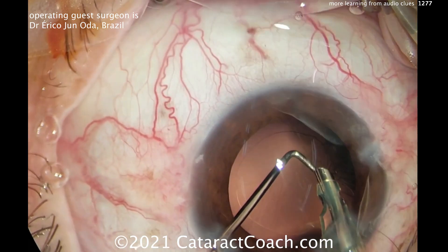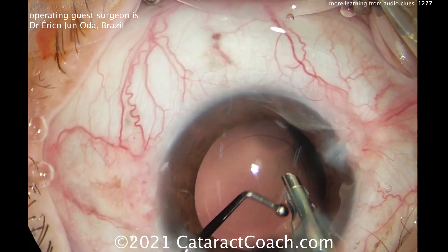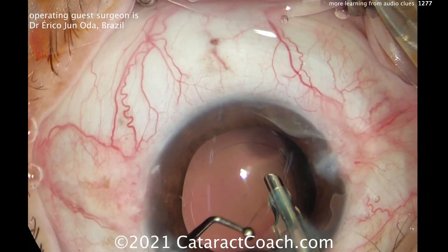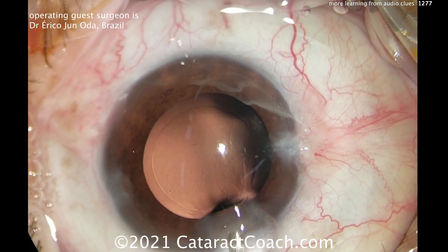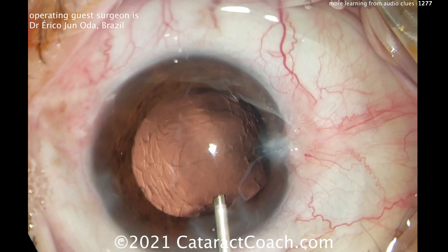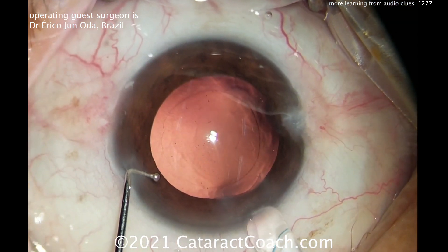Chopper in the safe position just to help keep the capsule bay. Personally, I would tell you to switch over to the IA probe for a higher margin of safety. I don't mind spending an extra minute per surgery, but I need to have the highest level of safety — I'm not racing anyone. So here we go, filling our capsule bag with our viscoelastic, and then the lens is going to come in next.